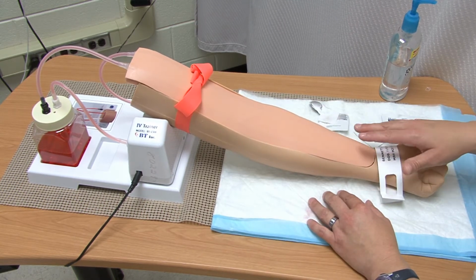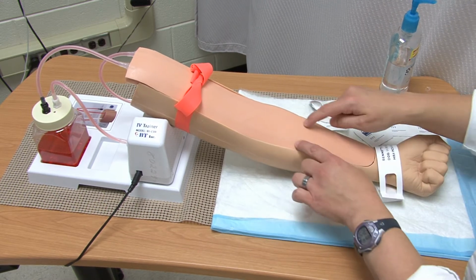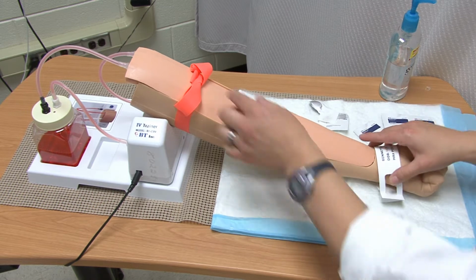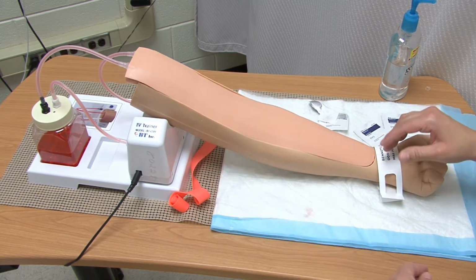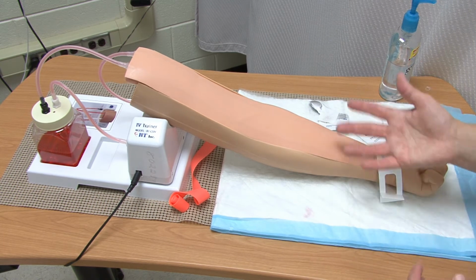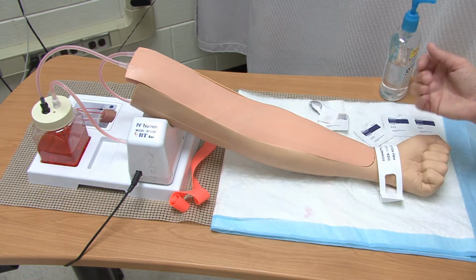So I've looked at his arm and I've confirmed, and I'm probably going to go in this area in here on one of these two veins. They are straight. There's no contraindications for it. So I'm going to go ahead and let the tourniquet off because, as we said, you really don't want to leave it on for longer than a minute. At this point, now that I've confirmed the site that I'm going to go to, I'm going to get the rest of my equipment and prepare it.